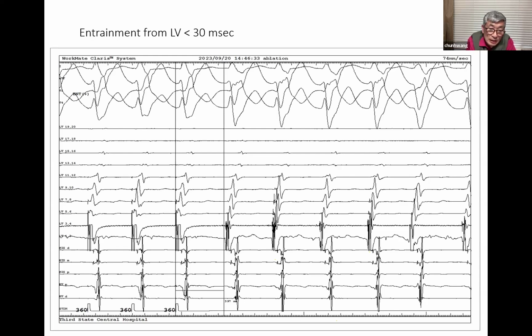Now, is there any trick for inducibility other than isoproterenol, rapid pacing, and so forth? I have not found any other trick once you have bumped it. Pace mapping can help you find a ballpark area, but I don't know whether that can confirm the diagnosis, since in a significant number of cases it is more of a focal behavior than true re-entry, as Karl-Heinz Kuck referred to before. But those make it completely different, and then your ablation would be way off. You don't know where it is.